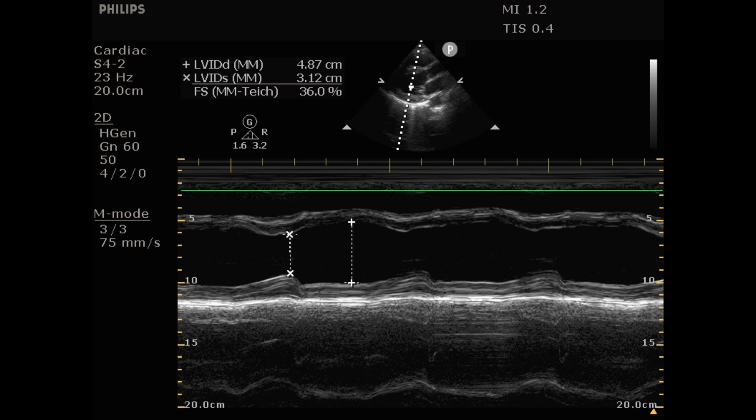And so what we're looking for is in systole, we're looking for the contraction, that narrowest place. So when systole happens, it squeezes and everything kind of goes closer to each other. And then in diastole, as the blood fills the chamber, we're going to see that open back up. And at end diastole, when the ventricle is filled as much as possible, the atria just popped in that little extra. We see it as big as it gets, measure those two values, and we can plug it into a formula to get our fractional shortening number. We'll talk about that in just a sec.